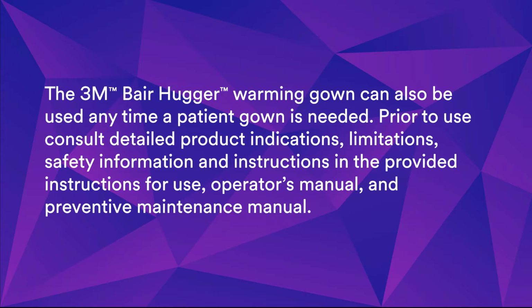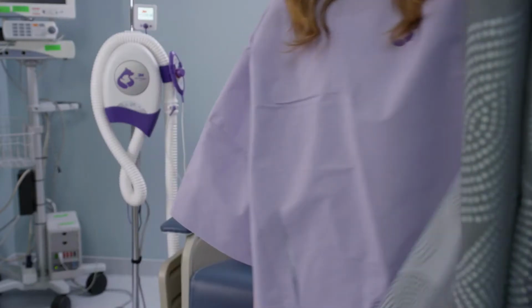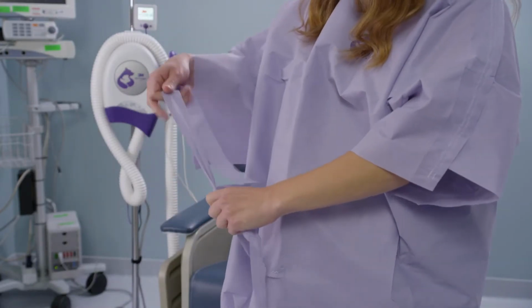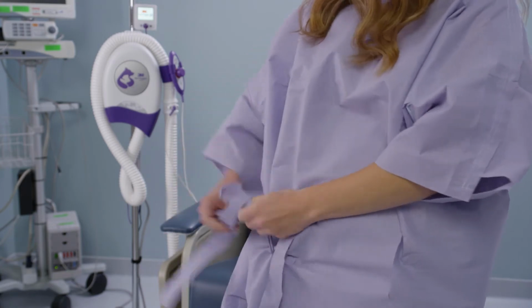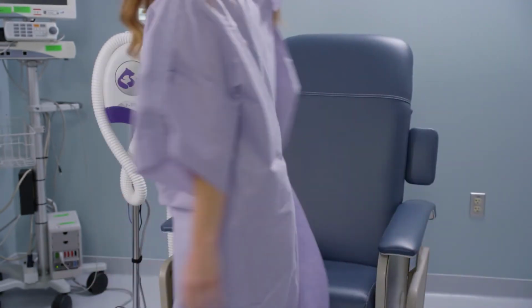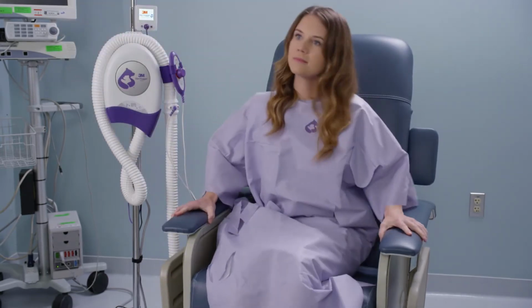Prior to use, consult detailed product indications, limitations, safety information, and instructions in the provided instructions for use, operator's manual, and preventative maintenance manual. Upon admission, the patient receives a single-use 3M Bair Hugger warming gown. Instruct your patient to put on the gown so the opening is in the back. The gown should be loosely tied at the side and neck to allow the air to circulate.